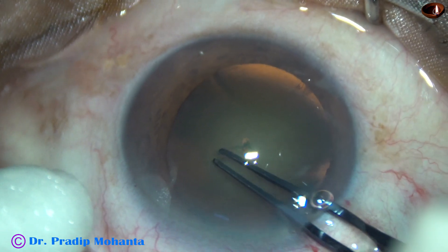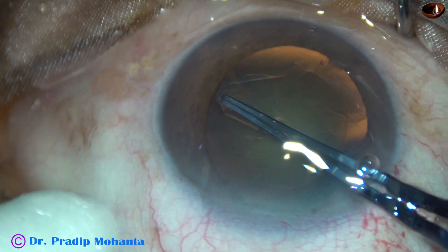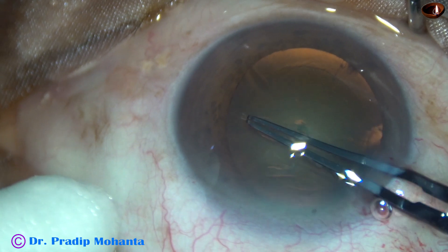See the whole lens pops. However, the rhexis was not difficult. I could do an adequate sized capsulorhexis, fairly round, in no time.